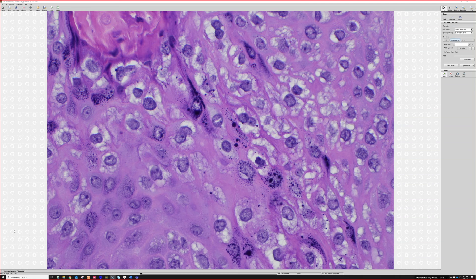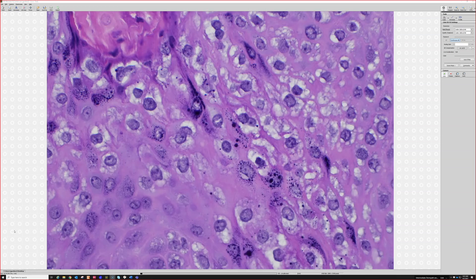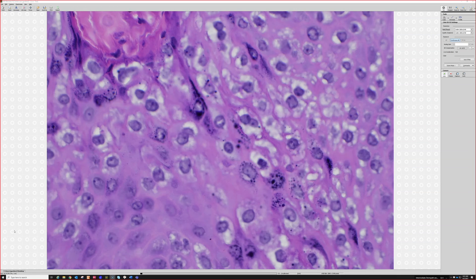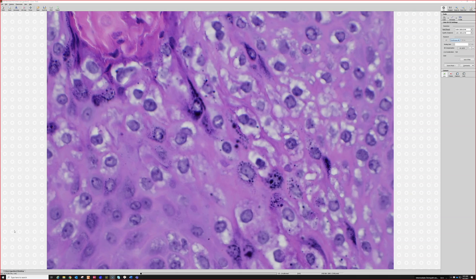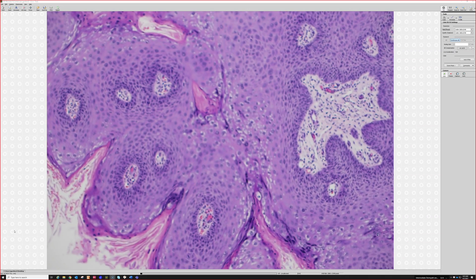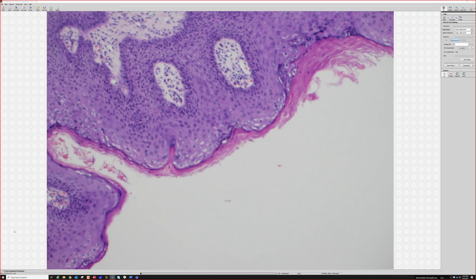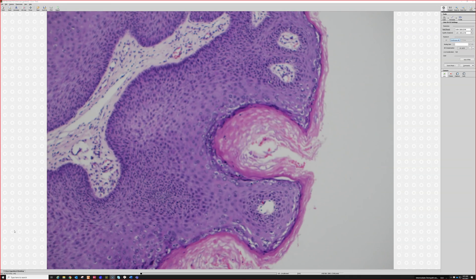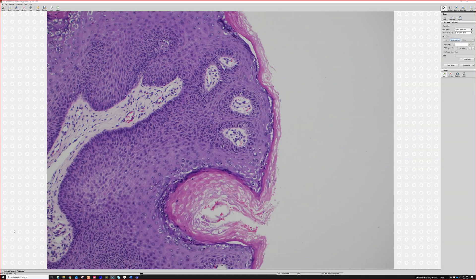We call this koilocytes or HPV viral cytopathic effect — they mean the same thing. To definitively diagnose condyloma, I like to see good koilocytes to be sure. Even though condyloma is not malignant, it is a sexually transmitted infection, and I don't want to label someone unnecessarily — there can be social ramifications. We always want to make sure we get the diagnosis right.